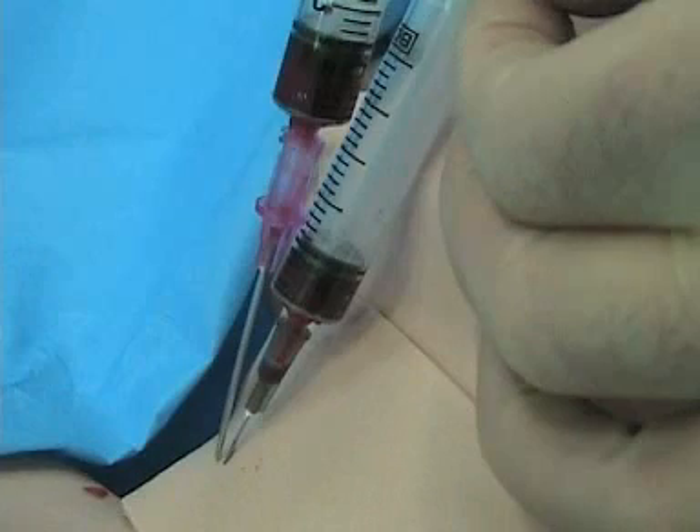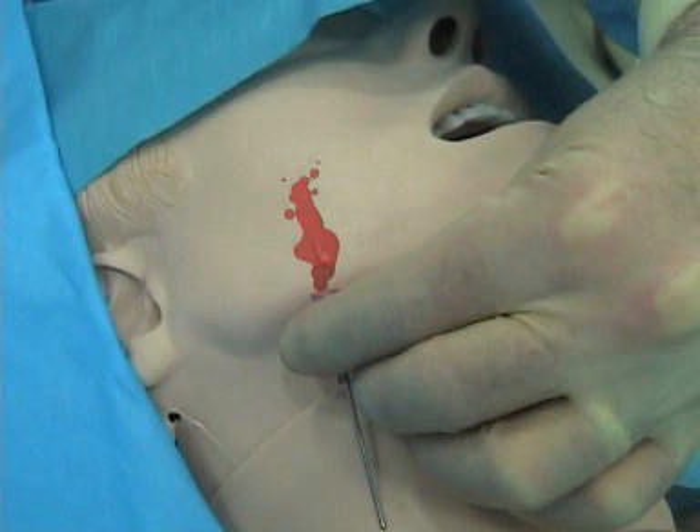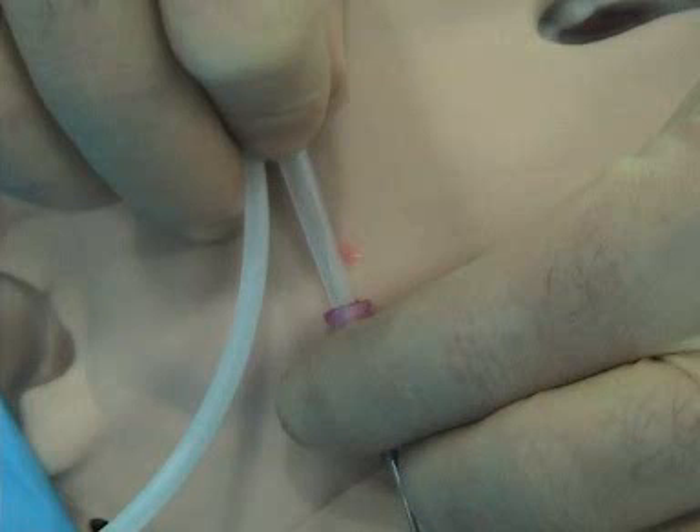I've laid it along the same direction as the finder needle and I found blood. Now we get rid of the finder needle and disconnect. If you hit the carotid, you'll see blood spurting out — you really don't want to see that; you want to see venous blood. Assuming you're lucky and didn't hit the carotid, now we put the wire in. Make sure you watch for ectopy, since you can put that wire all the way into the right ventricle and cause some ectopy.